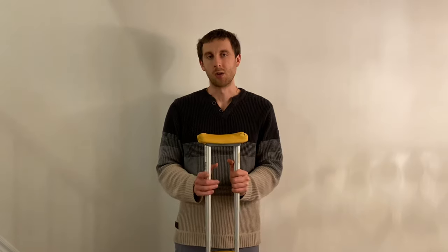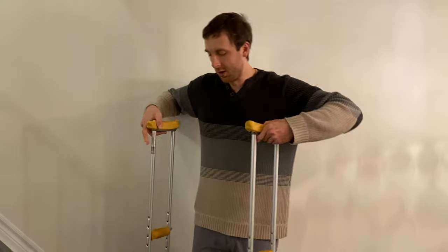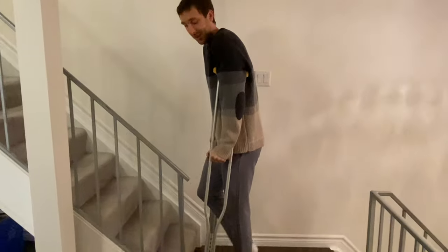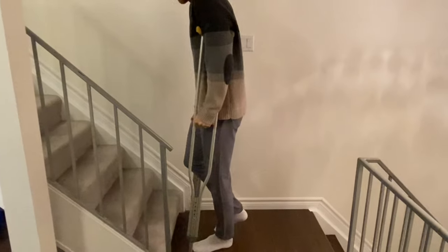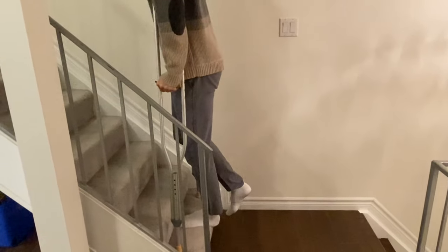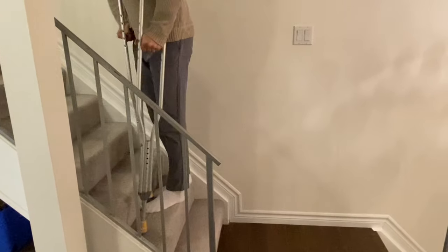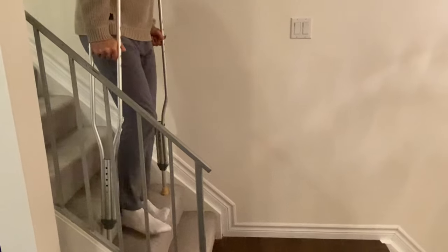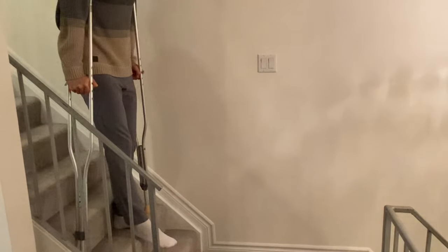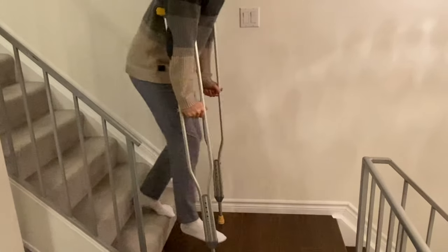Now we're going to practice going up and down the stairs with two crutches, as if you weren't able to put weight on the leg. Usually it's easier to keep the sore leg behind you going up so it doesn't clip the step. Lead into the crutches, push down with your arms, hop up, and crutches come up last. Going down, the order is opposite — sore leg is out in front, bring the crutches down first, lean forward slightly, and then step down.